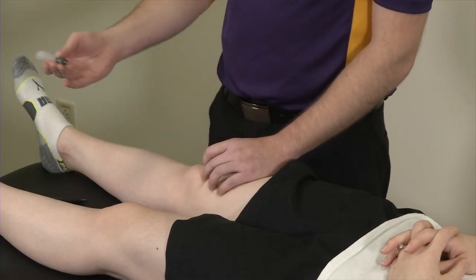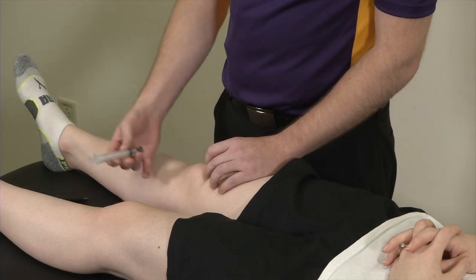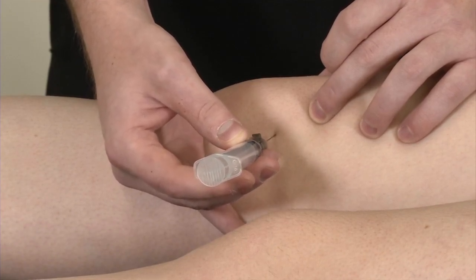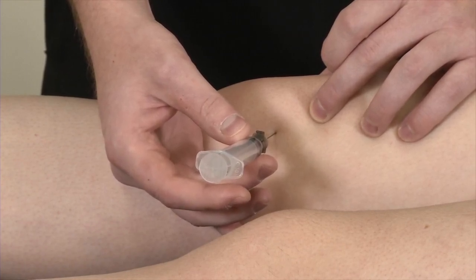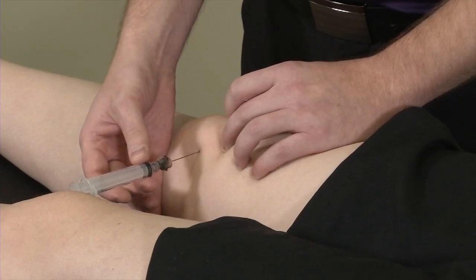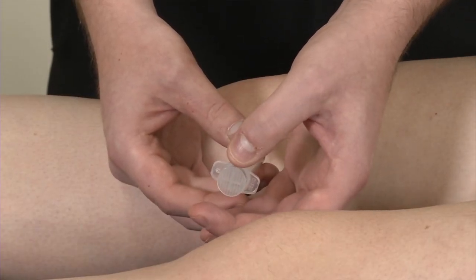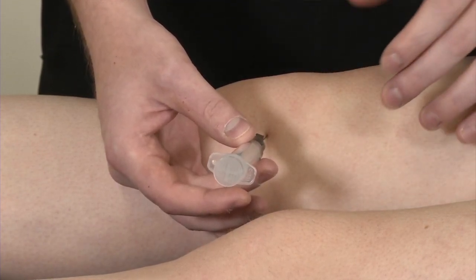I then use my needle with whatever my injectate is going to be for the procedure. The approach is going to be perpendicular to the plane of the foot. As I have my needle set up perpendicular, I'm going to approach that mid portion of the kneecap in that same plane. You then advance the needle roughly about a centimeter or until you feel the pop of the capsule. You then adjust the needle so that you're going to drop the syringe or adjust the tip of the needle superiorly, maybe 10 to 15 degrees, and then advance another one or two centimeters. At that point, you can aspirate your syringe, making sure that you're not in some blood vessel, and then you can go ahead and plunge the syringe to inject whatever injectate you're using.